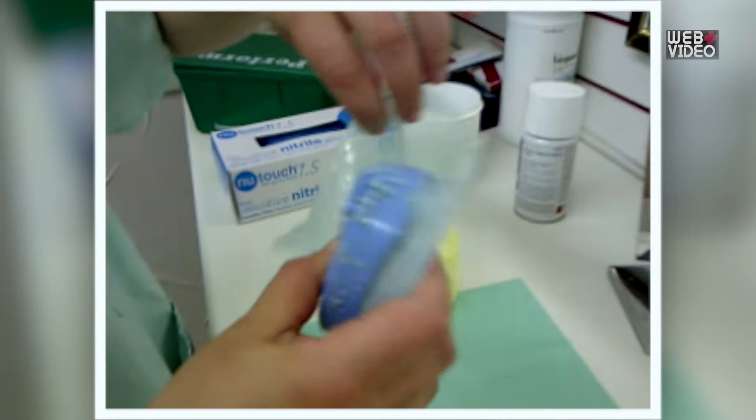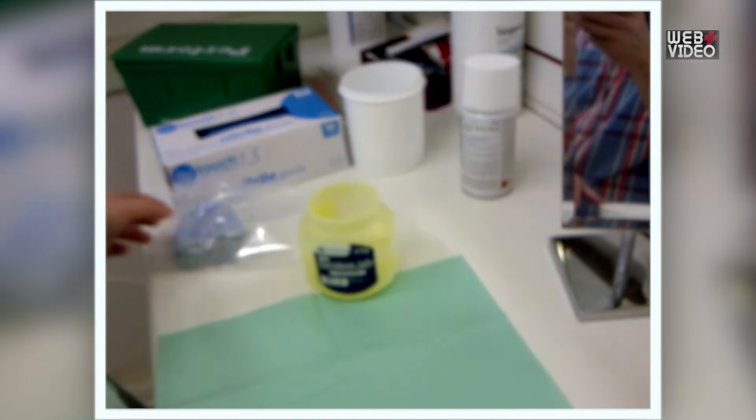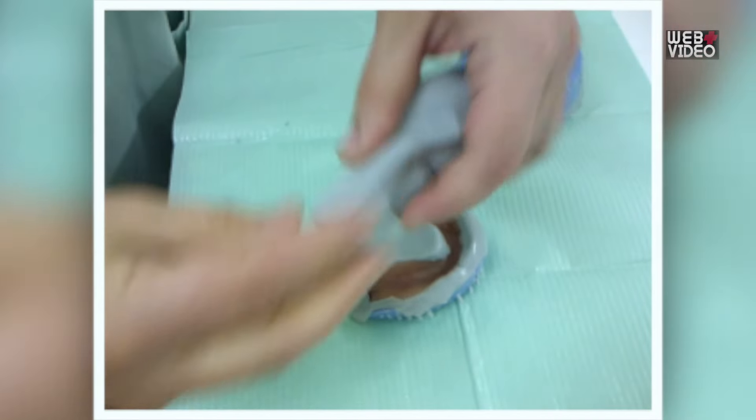Step 4: Place your duplicates in the bag provided. Step 5: Repeat this process with the other denture.